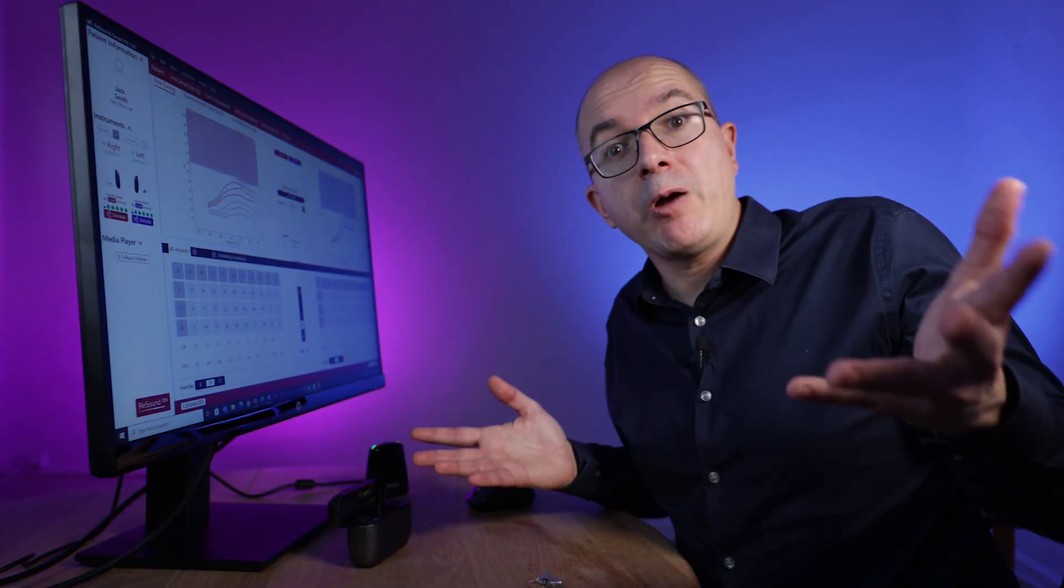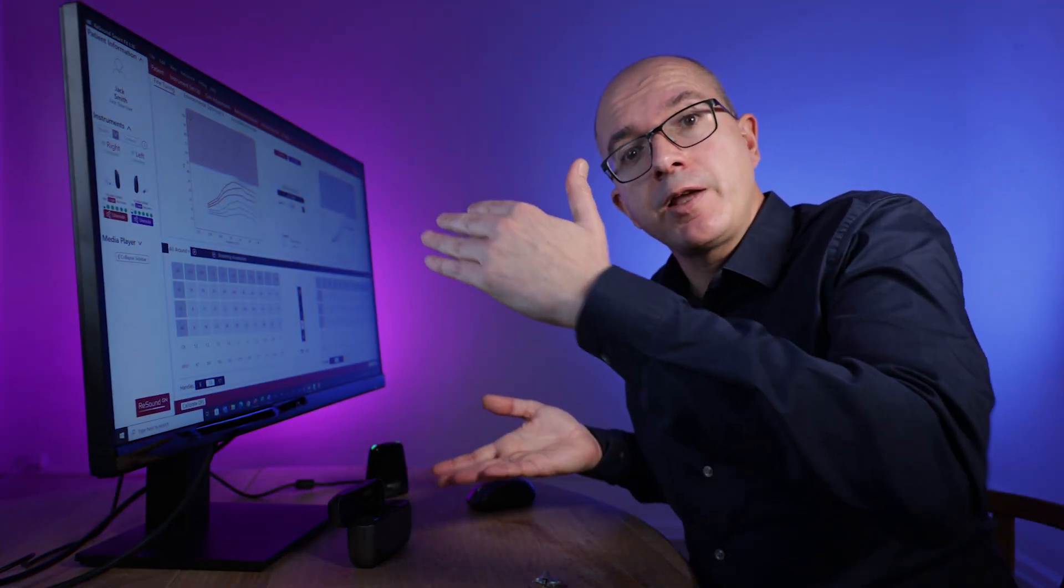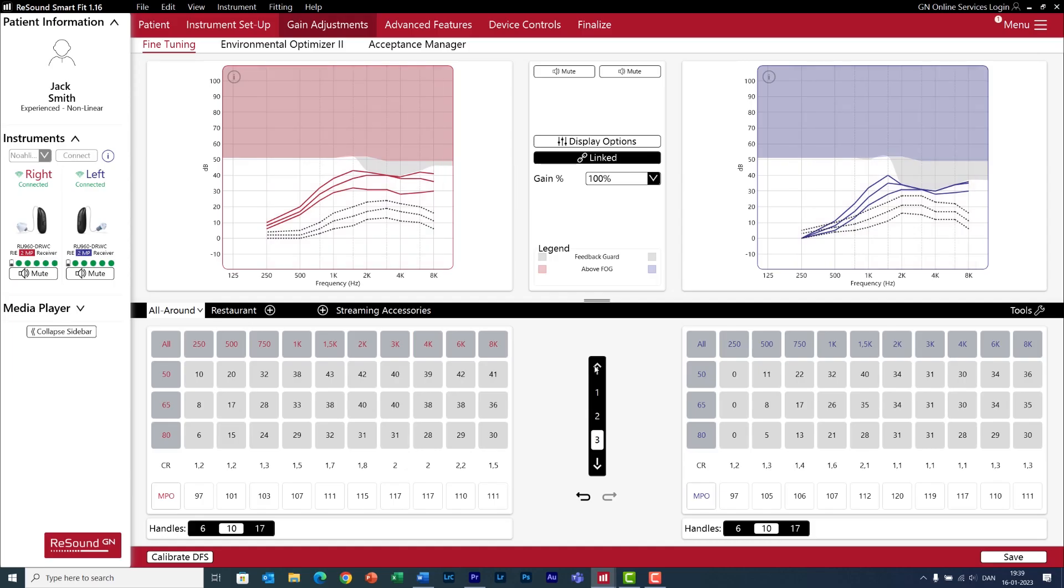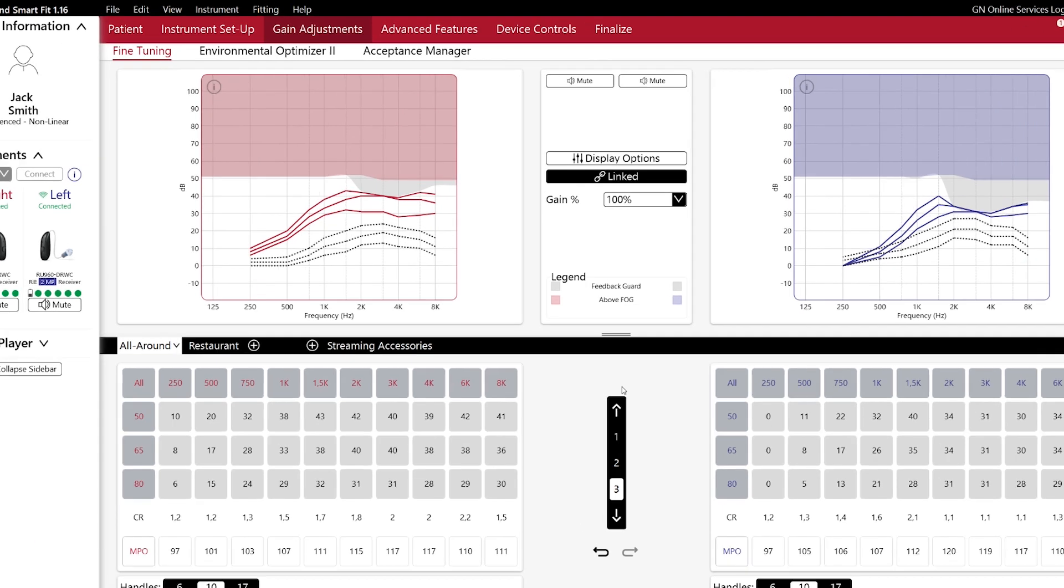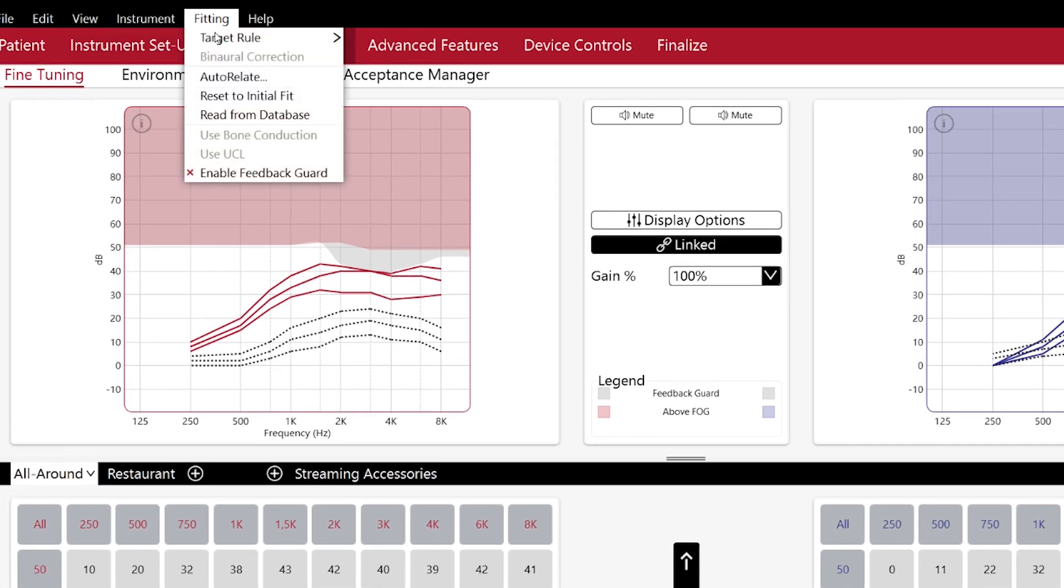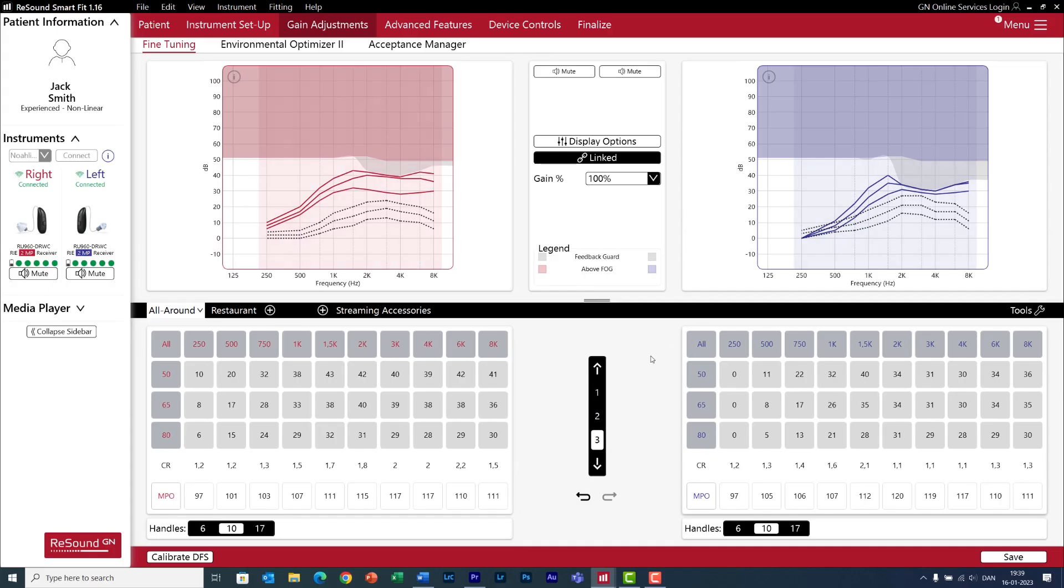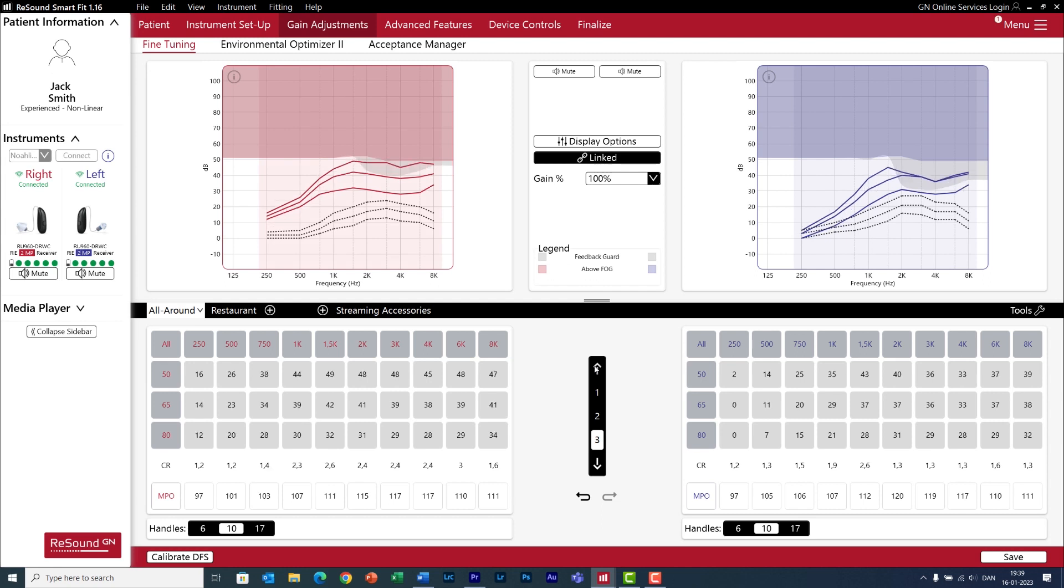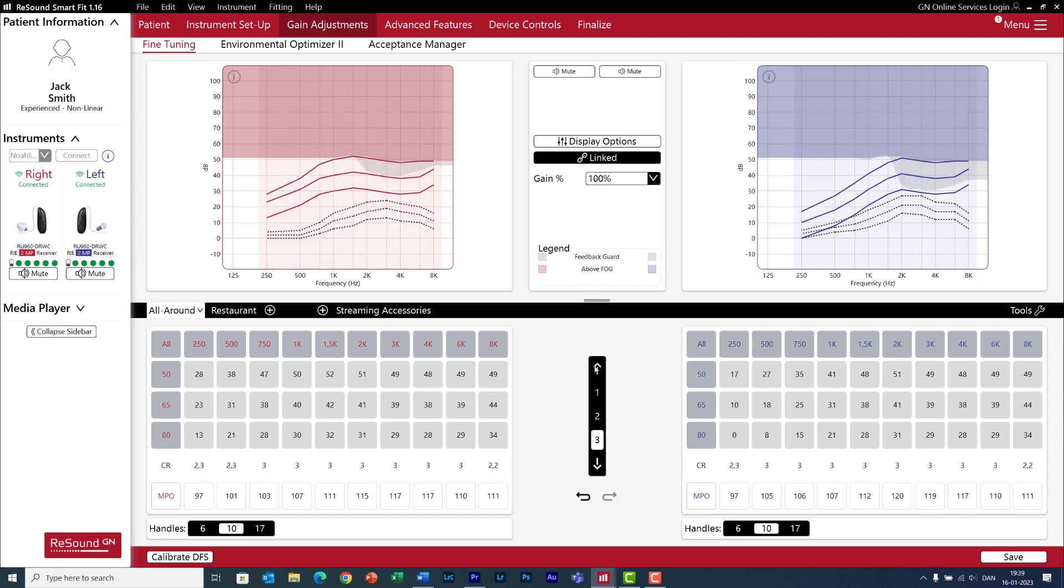But Miguel, how can it be? You told us that you can give all the gain you want. Well, if this happens to you, go to fitting and check whether feedback guard is enabled, as it is right now here. Let me deactivate it. And hello. Now, there is no limit of how much gain you can give.